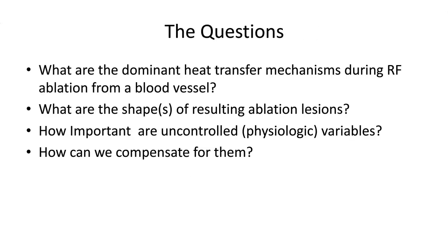The example that I'm going to use here is a very simple study of RF ablation in a piece of tissue that's adjacent to a blood vessel. As a bit of background, RF ablation is an essential tool in many medical specialties. You can think of it as surgery without a knife because its purpose is to remove tissue that's causing disease from inside the body without having to cut down to that tissue.